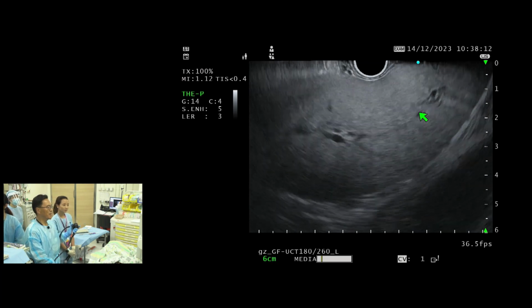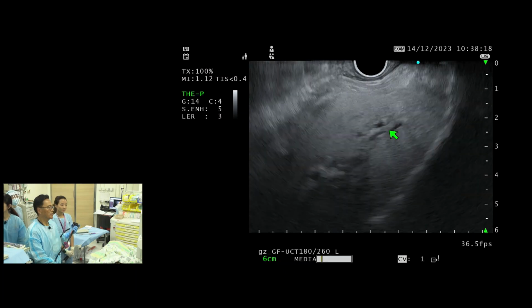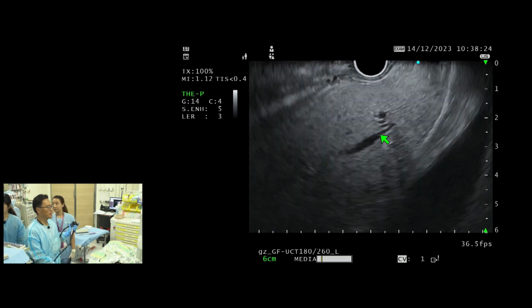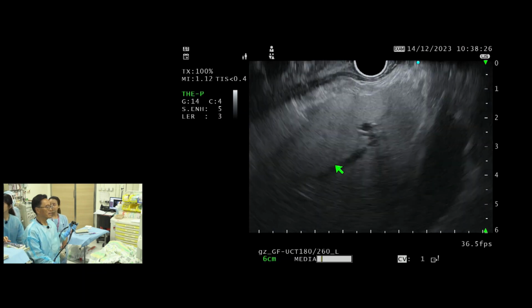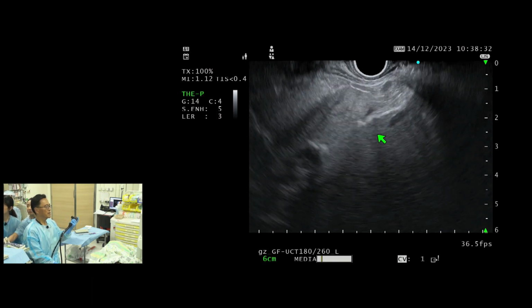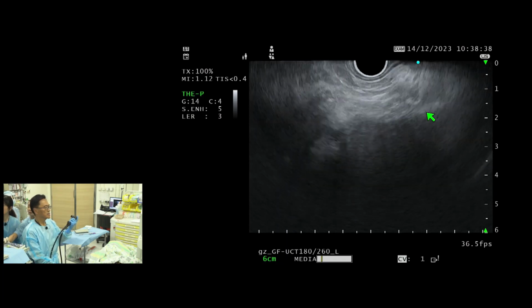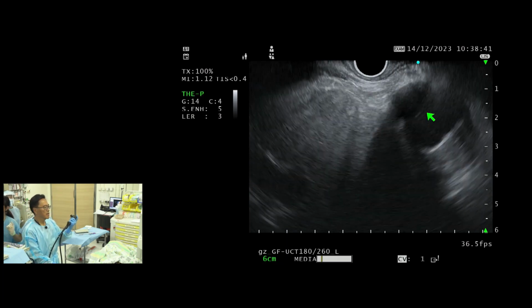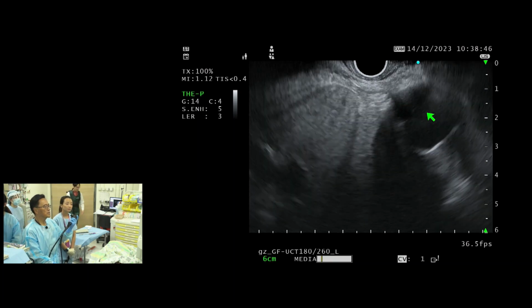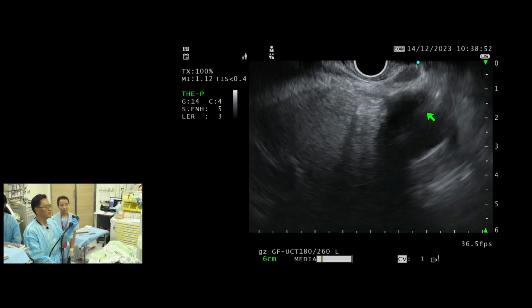Now we're going to follow the left hepatic vein towards the IVC. So I'm pulling my scope back while following that left hepatic vein. That's over there, and I'm pulling back, pulling back. Okay, so now I'm going to rotate to my right, and we're going to see here. Let's see here. Yeah, IVC. Yeah, so that's the IVC, where the arrow is. And then you can see the right hepatic vein coming into the IVC. Just if you can move the cursor to the left a little bit.